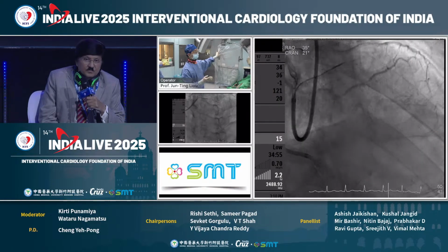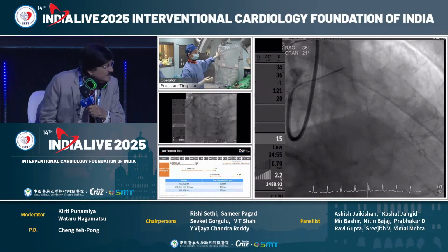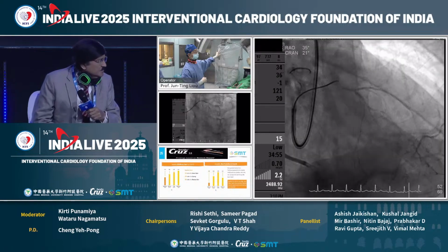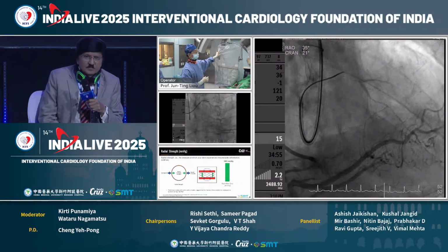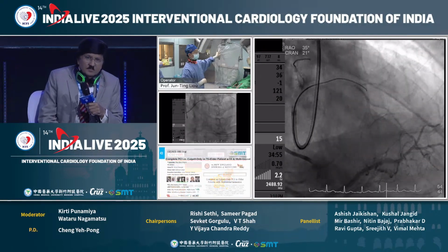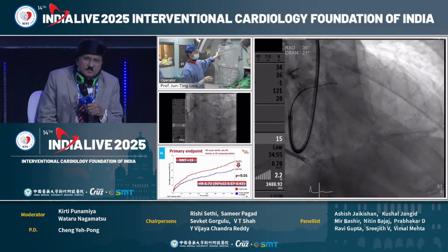So I gave up the plan and pulled the microcatheter back to the CTO. And I tried again to use the wire with a deviation to bring the wire down. Maybe the wire can still go outside the lumen, but after several attempts, I used a different direction.